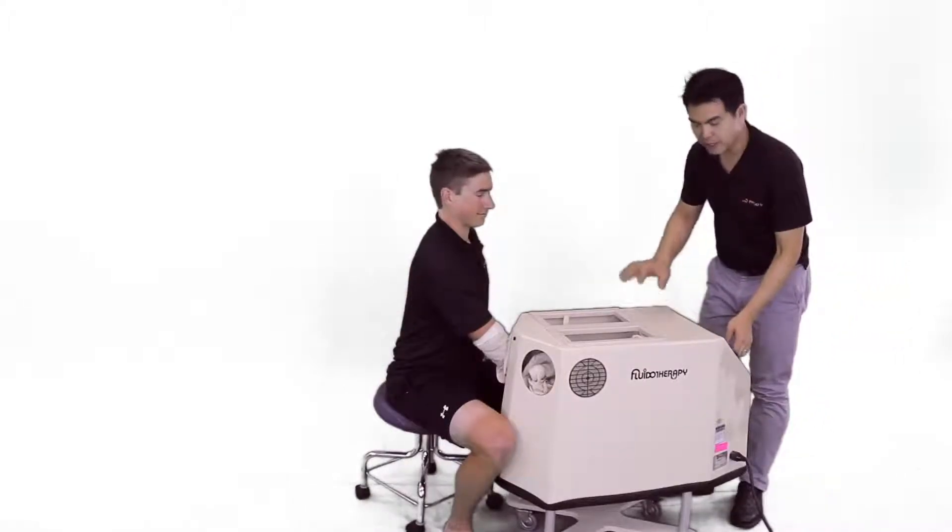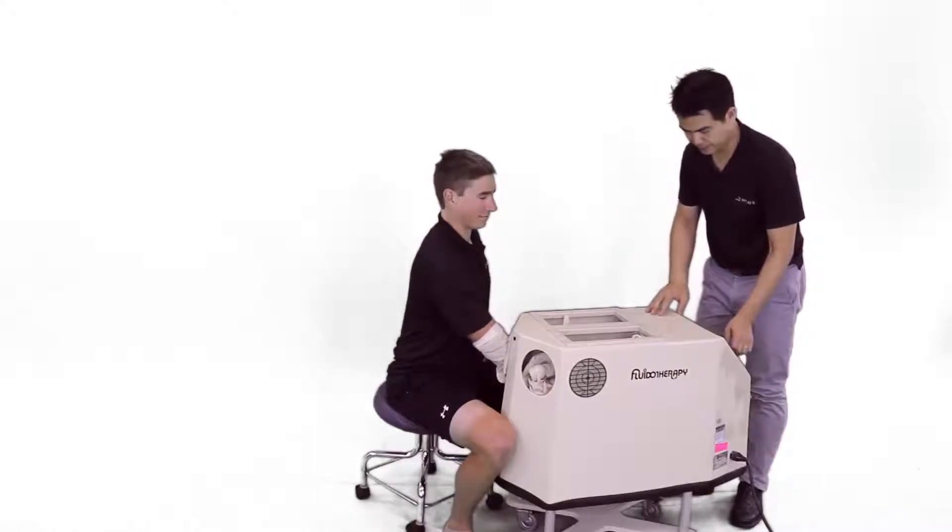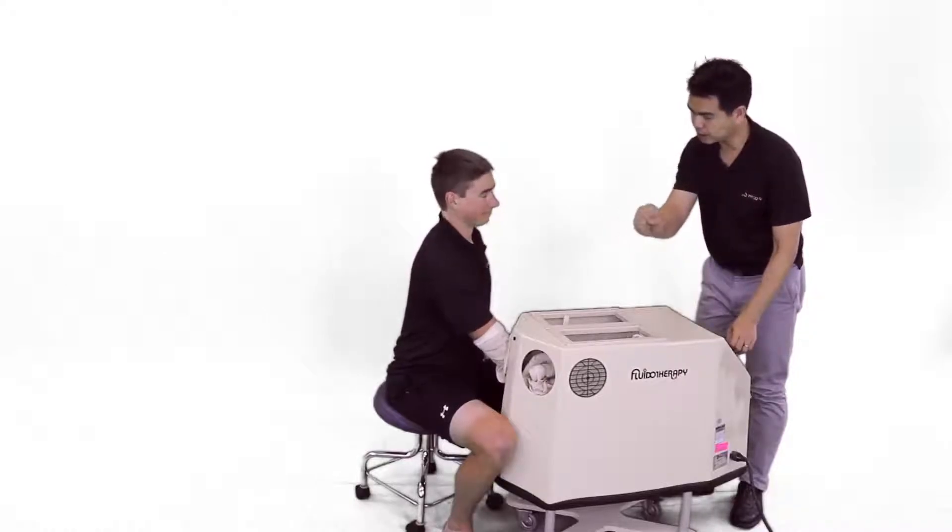We can adjust the level of agitation based on the patient's comfort. How's that? Good, and you're working on it. Great.